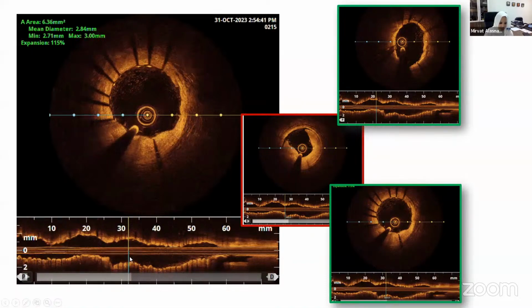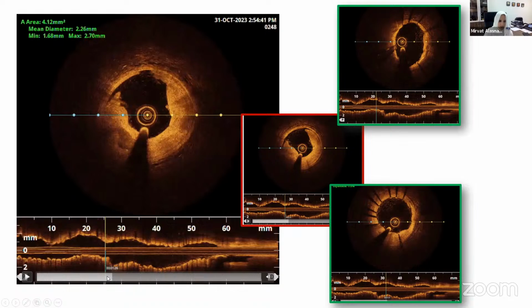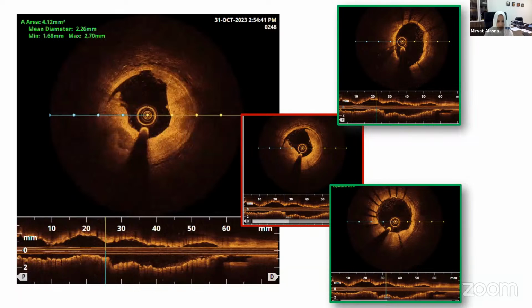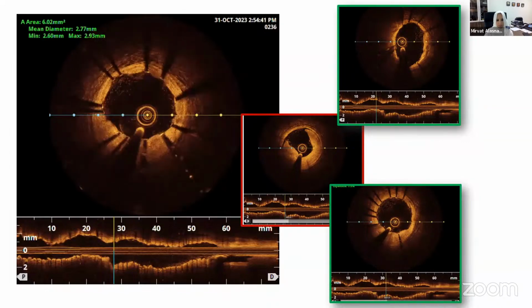And I'm going to see if I can somehow show it to you here. Yep, right there. So if you see the image that's running, we're looking at the stent, but then there's no stent, right? So you see stents around 4 or 5 o'clock, and you then don't see any more stent struts. So it's a very tiny, short segment where we have no stent struts that we're covering right here. See that? And then we come back and we get our struts.